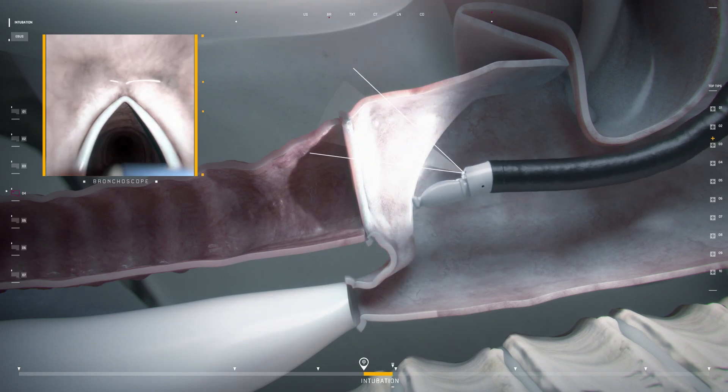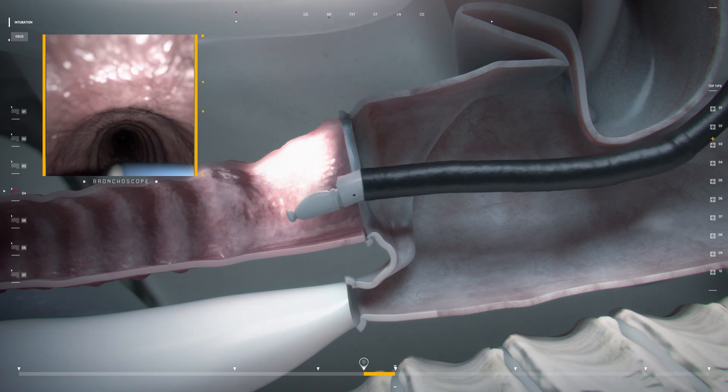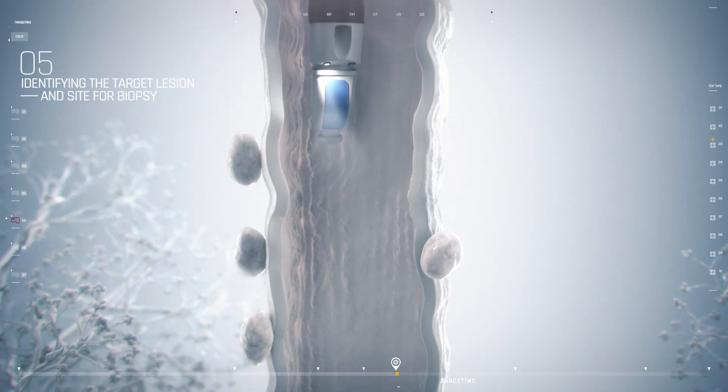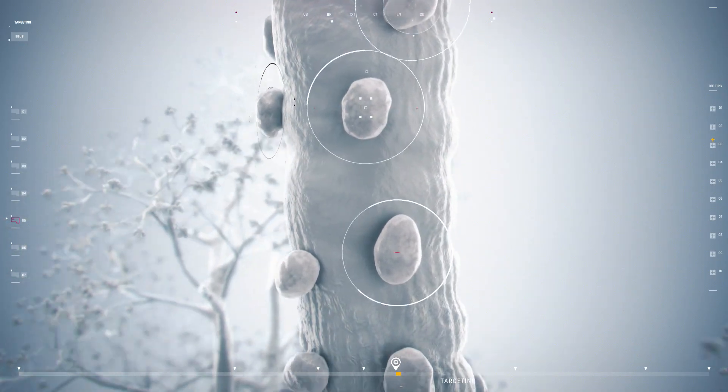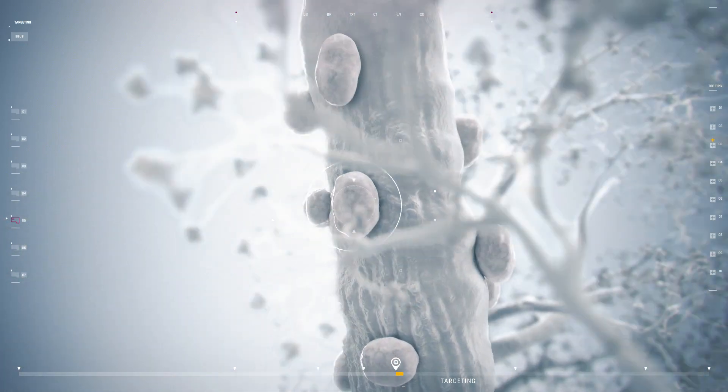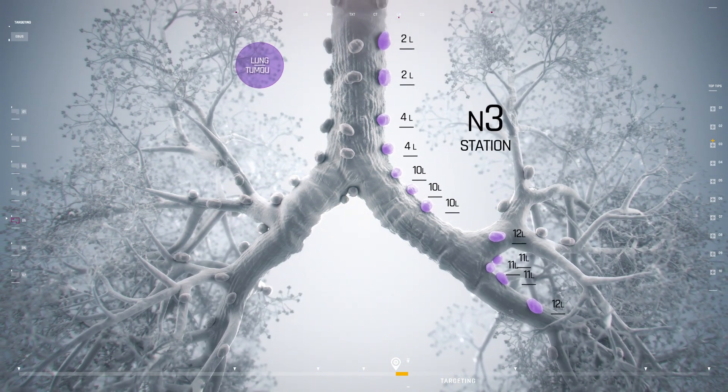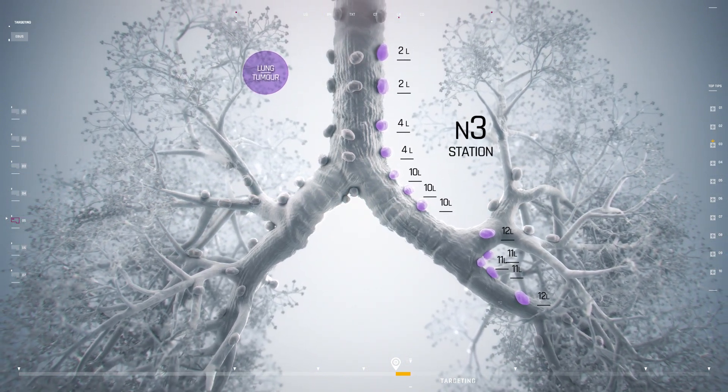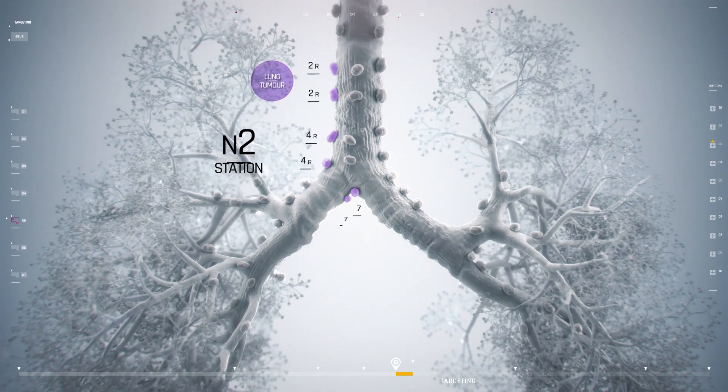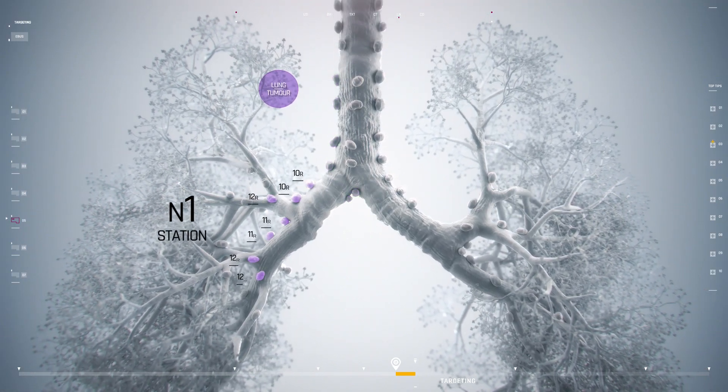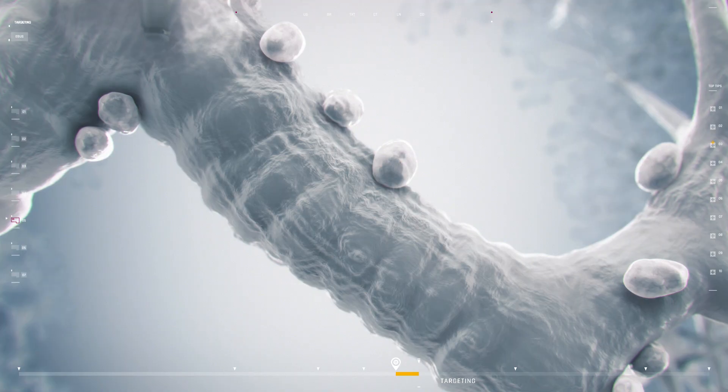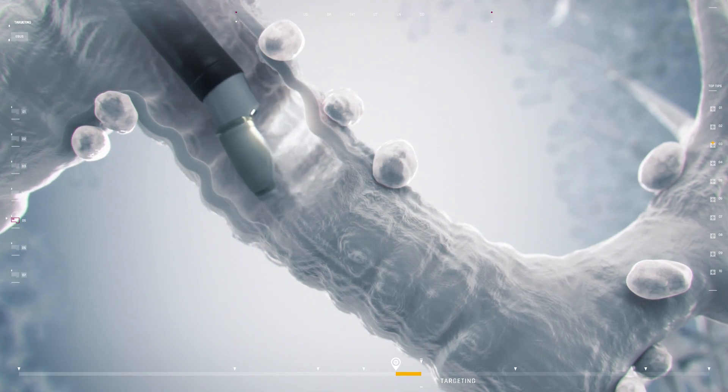Once the bronchoscope has entered the airways, the target lesion can be located. For a staging EBUS procedure, N3 lymph nodes contralateral to the primary tumor should be examined first, followed by N2 nodes and finally N1 nodes to prevent upstaging the disease.